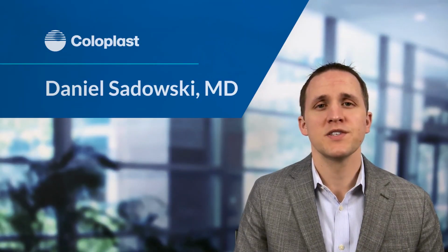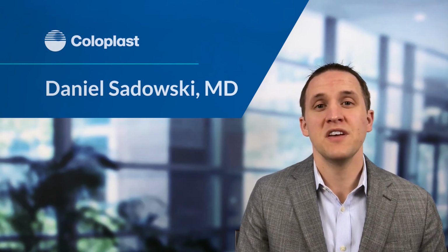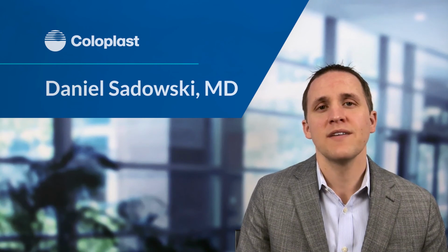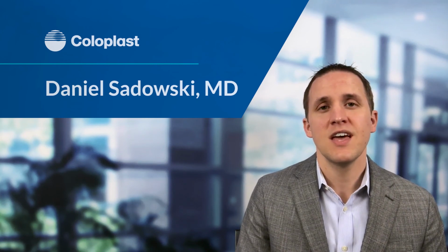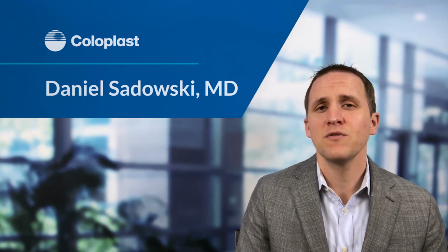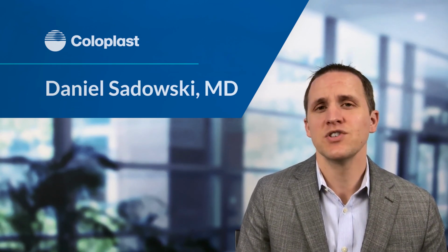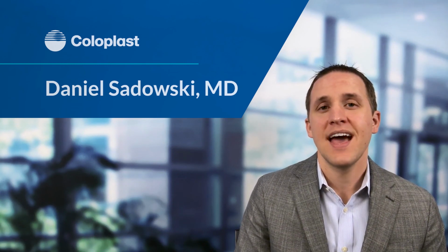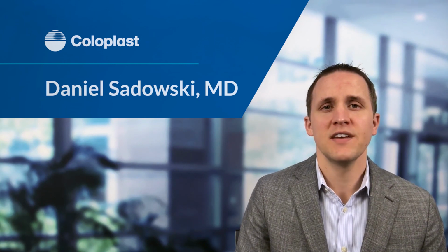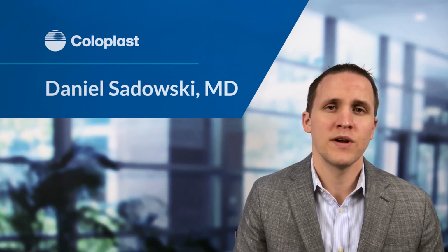The two main risks with a penile implant surgery that I emphasize include that of infection and mechanical failure. In either case, you would have to remove the device and possibly re-implant one. The mechanical failure, as I mentioned before, is about 20% at 10 years out after surgery. As for the infection risk, that's about 2 to 3%, and if there is an infection, then it would need to be removed. Sometimes we're able to replace it.